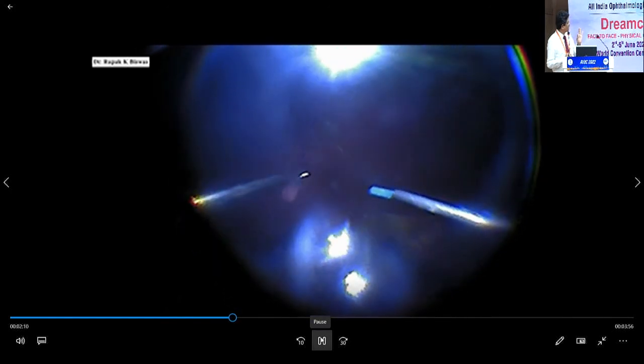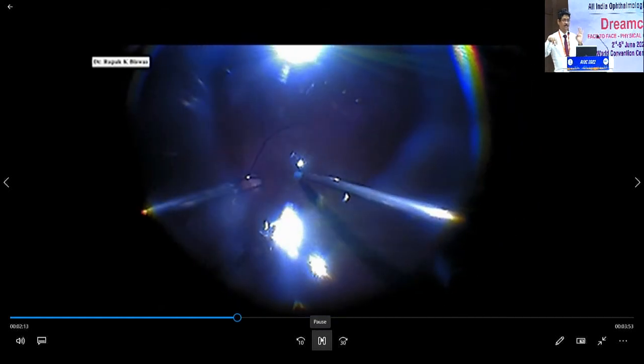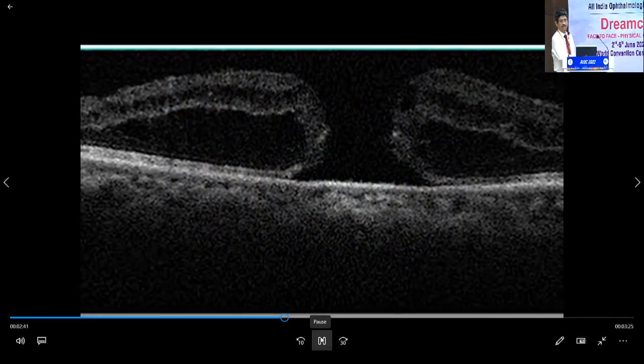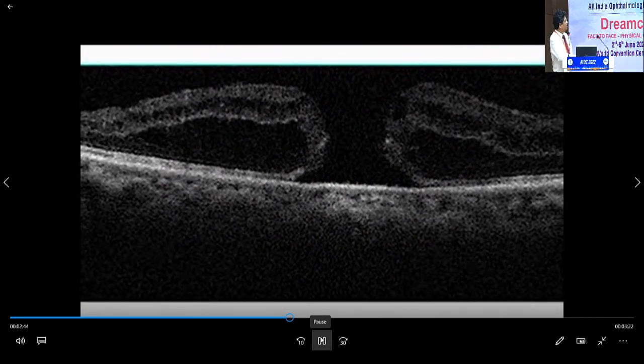Once you take it, you have to hold it in that position. The first part — stabilization — is done under saline. Then you do a fluid-air exchange and place the graft under the air, gently tucking it with your silicone tip. The rest of the fluid has been taken out, and this donor site is being lasered. Then gas tamponade is applied.